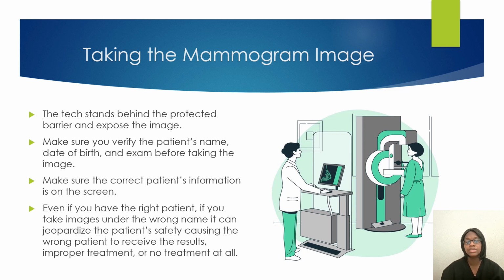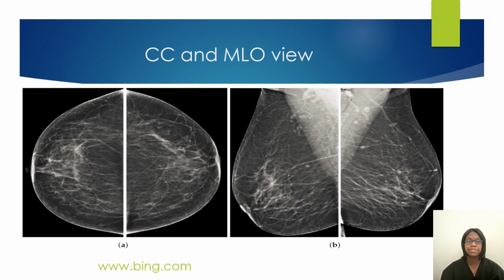Don't be in a rush. I know it's easy to rush and try to get patients in and out, but you don't want to take images on the wrong patient.